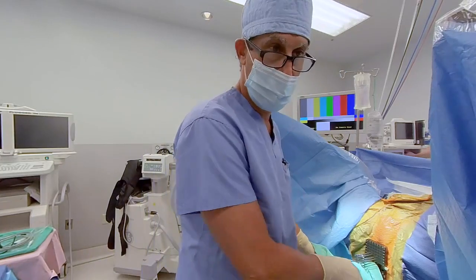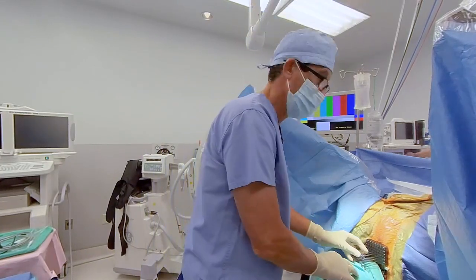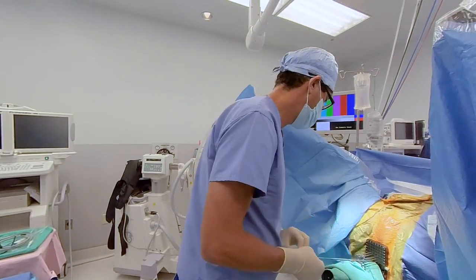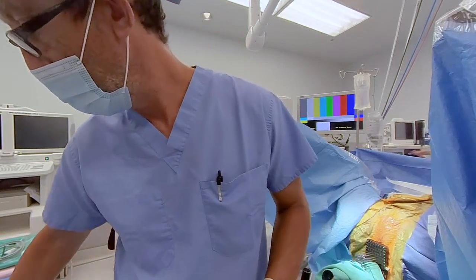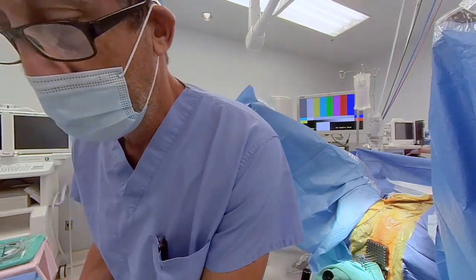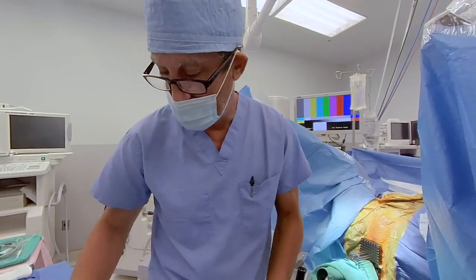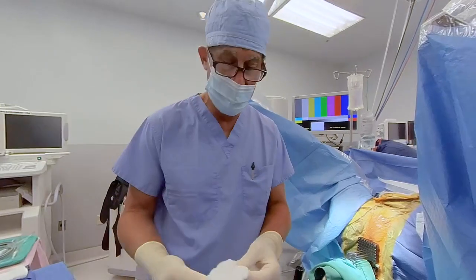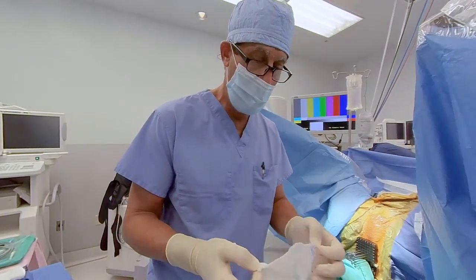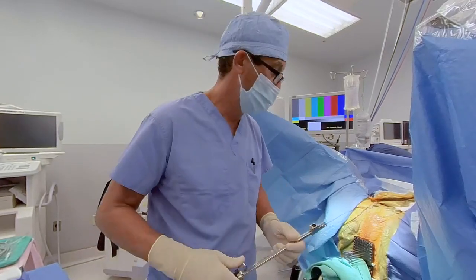Okay, so we're ready to rock and roll. First needle is 4 Charlie primed. So again, I like to have the table at an angle so I have everything in access to me, so I can try to be efficient. We have a wet 4x4 that I like to place up here that we can clean the trocar with when we need to.